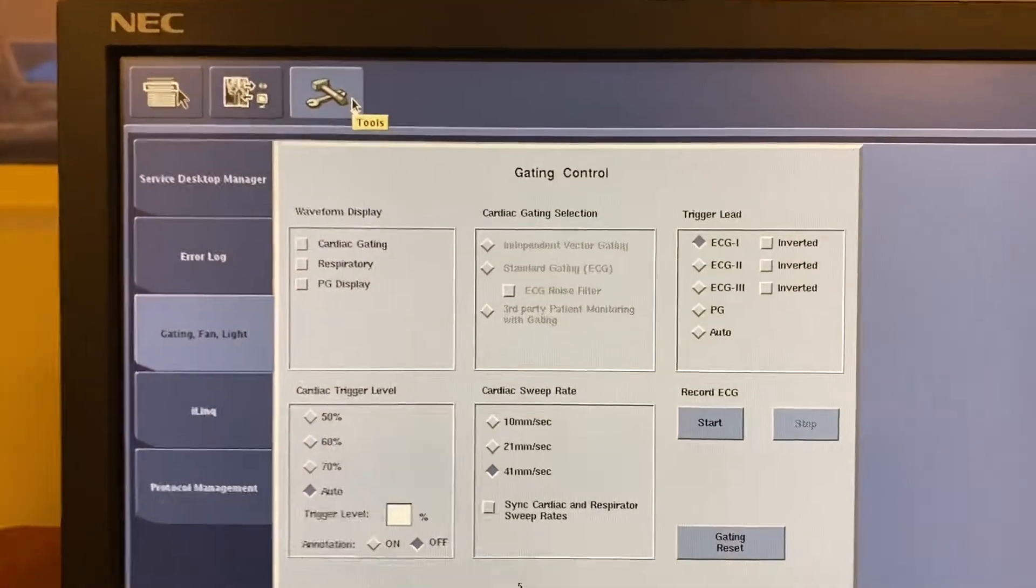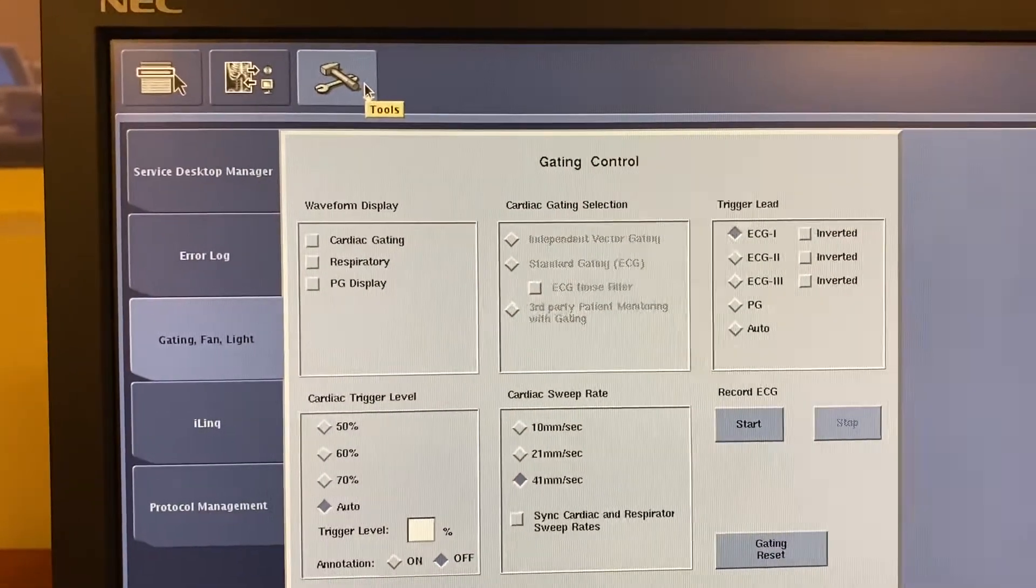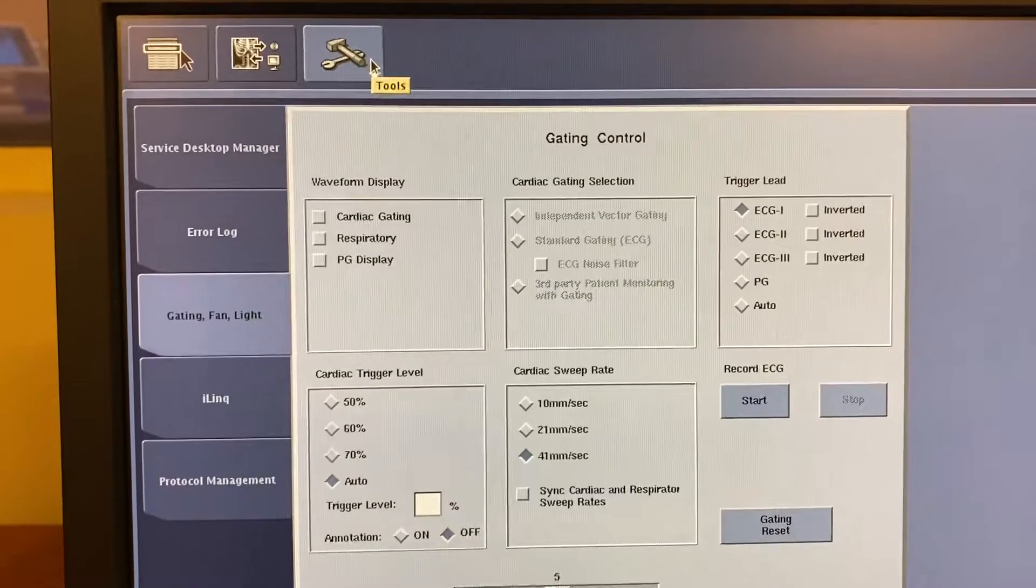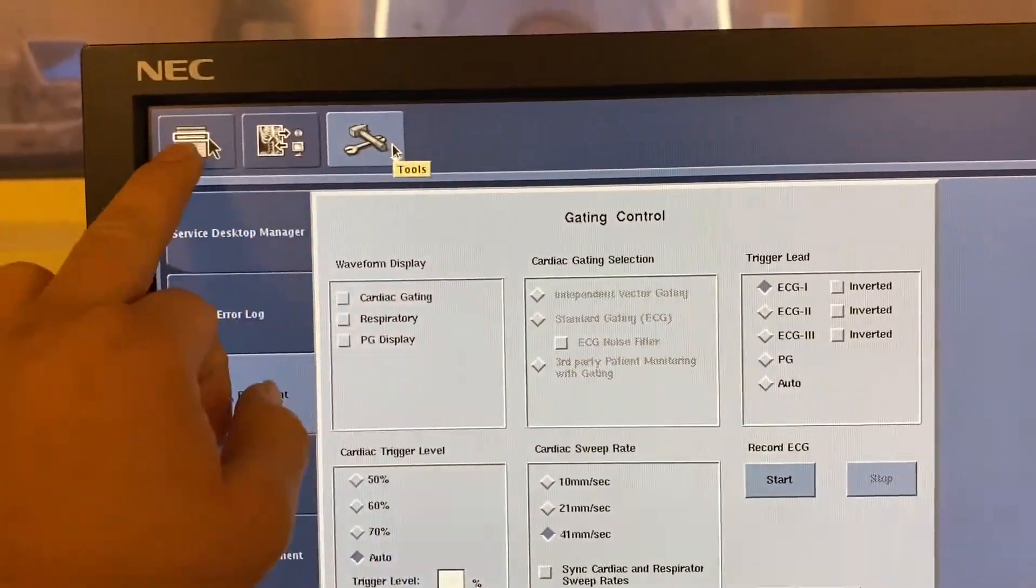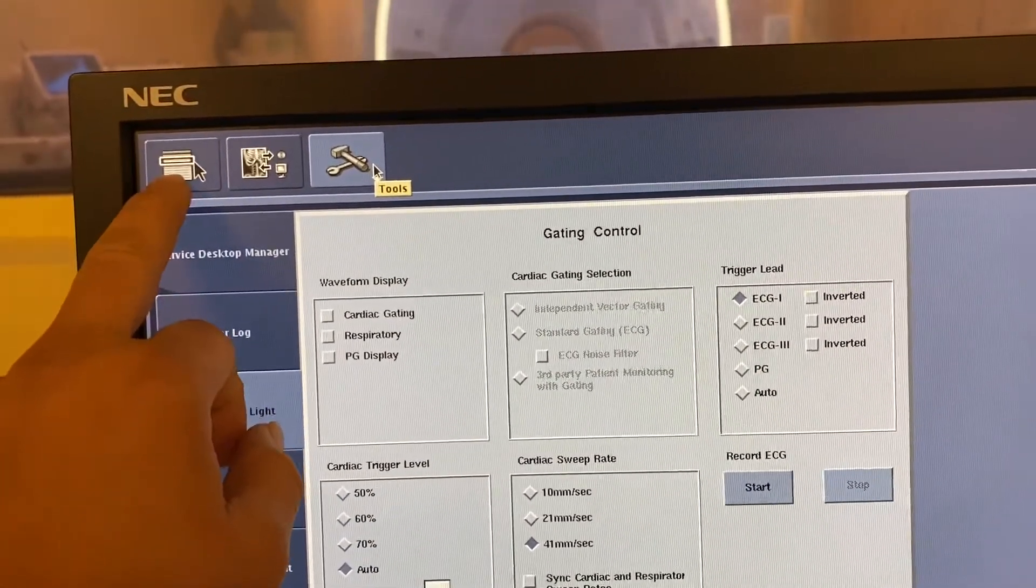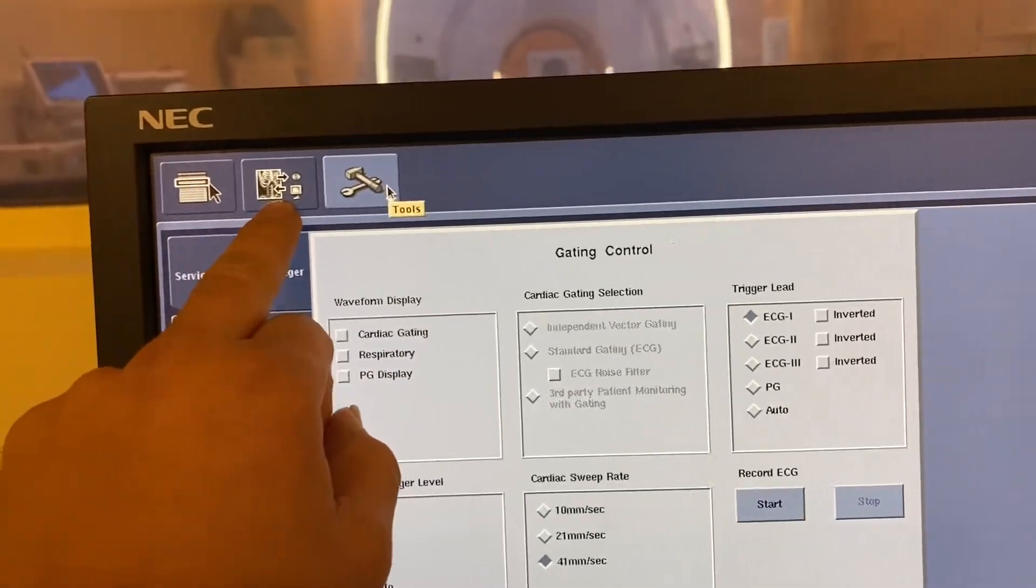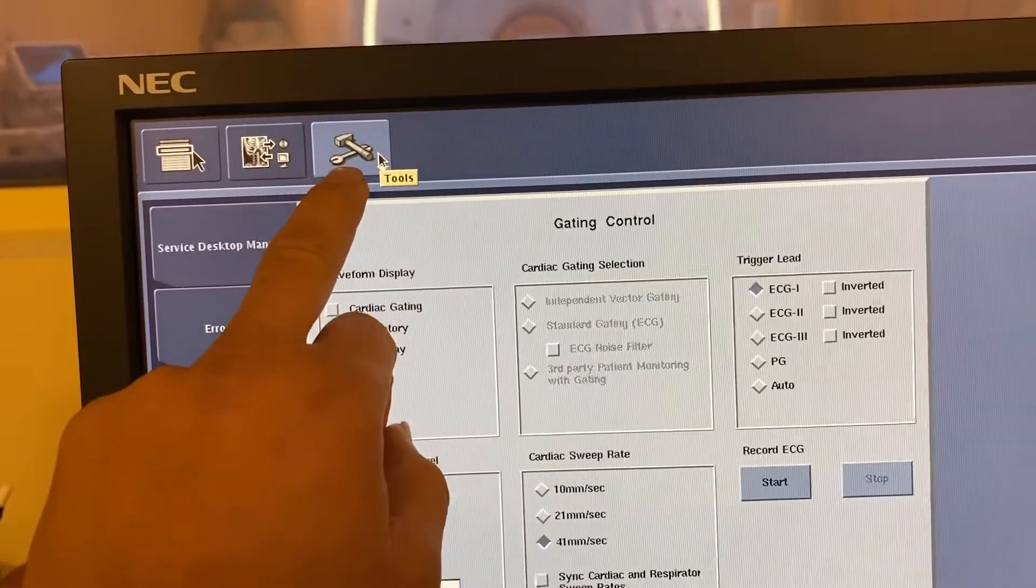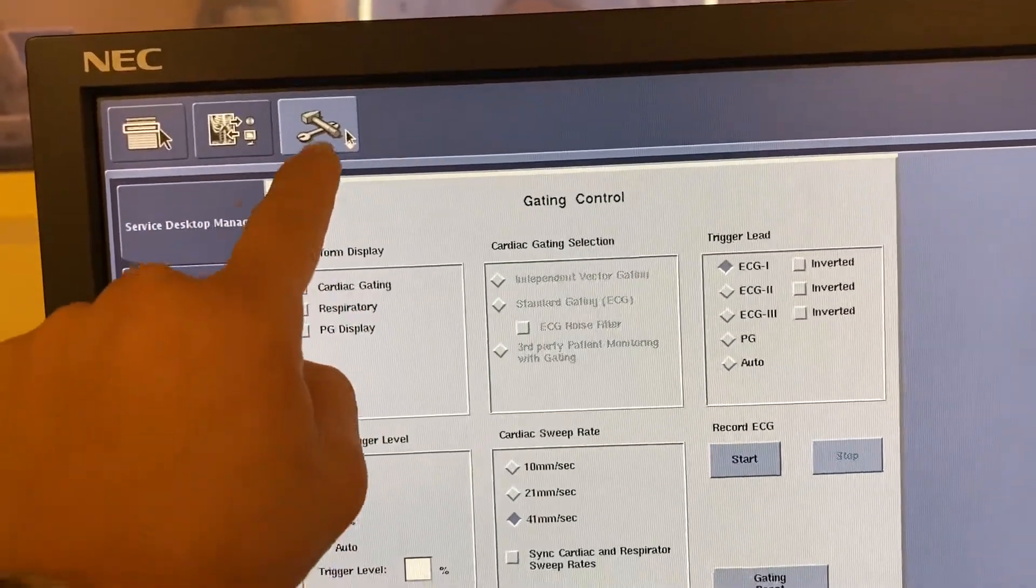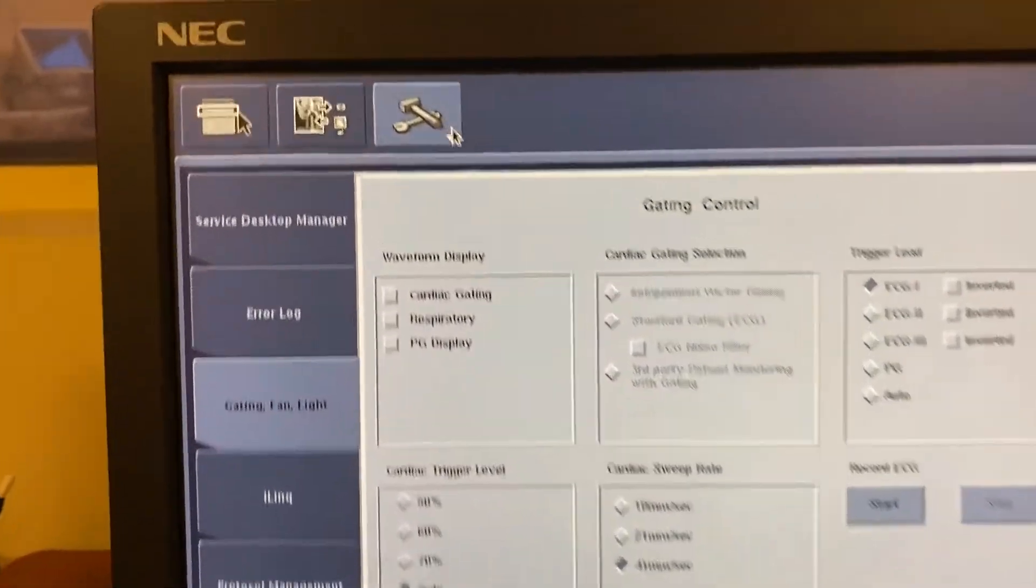This video is how to program breath holds in a GE MRI machine, possibly running on 23X. You got these three icons here. This is where you pick up patients, this is where exams are done live, and the last one here is the tool setting. Click on that icon.